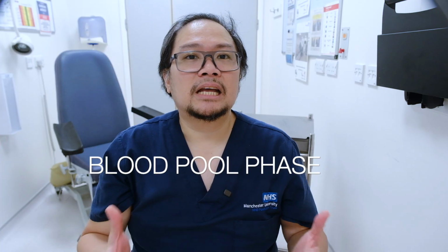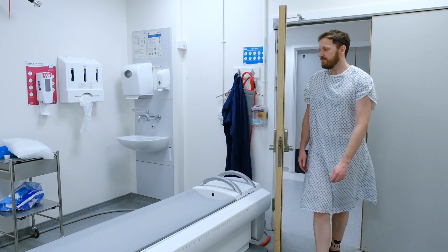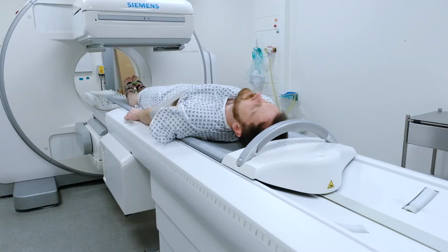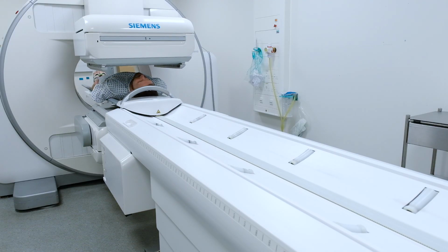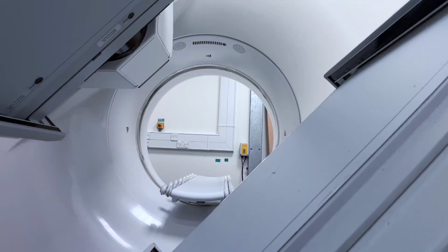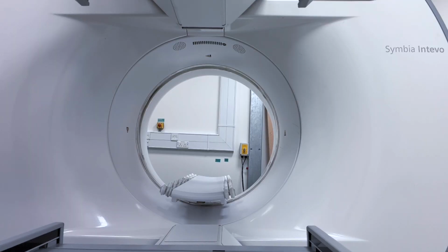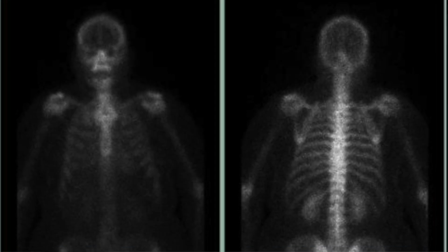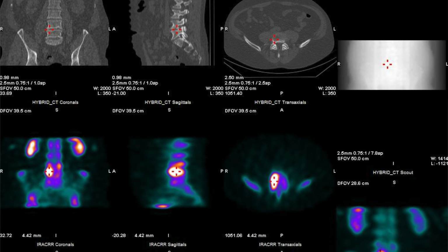After 10 minutes, a static picture is taken. For the delayed phase, we will initiate a whole body scan, during which the patient will be scanned from head to foot, followed by some static acquisitions. A SPECT CT might be necessary, which may require further justification if needed. The images are processed, saved, and available for the consultant to review.